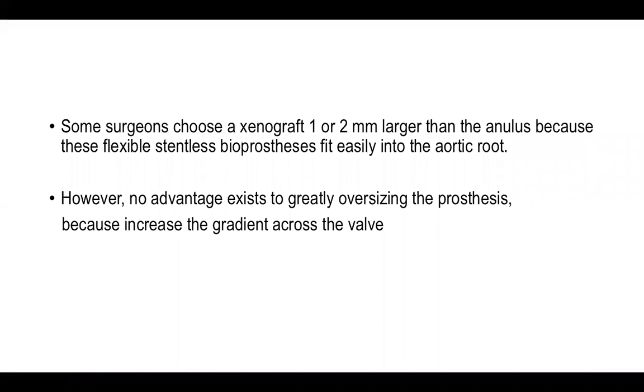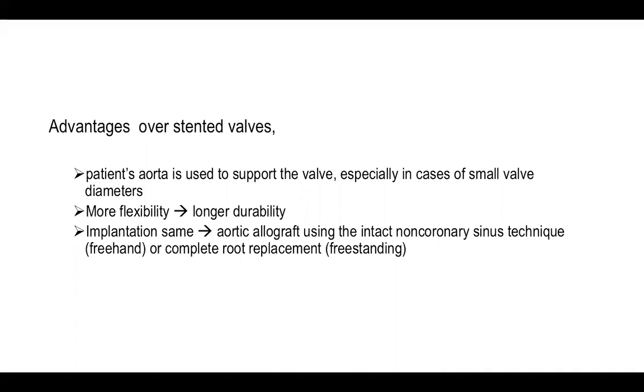So some surgeons select 1 or 2 millimeters larger than the aortic annulus because the stentless device is flexible and easy to incorporate in the aortic root. The advantage over stented valves is that the patient's aorta supports the valve, especially in case of a small valve, with more flexibility. So it will last a longer time, with better durability.